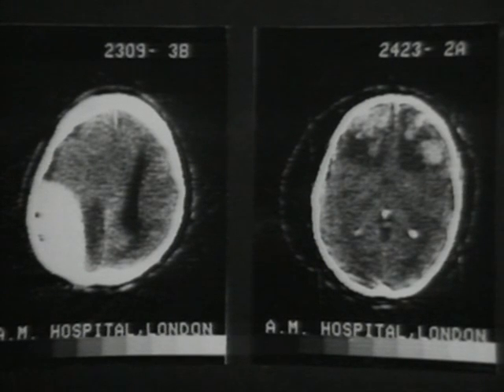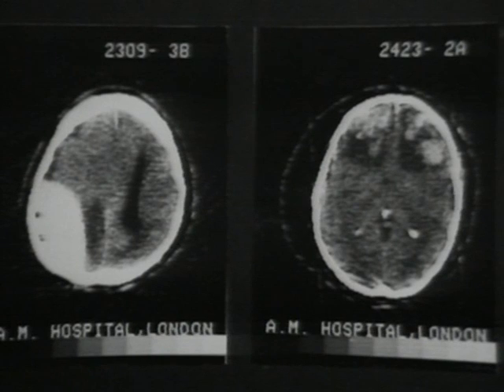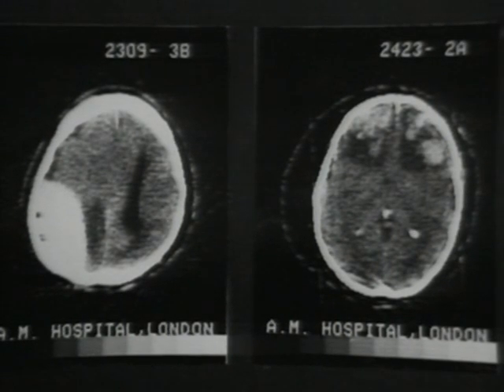The next patient is a different problem. This was a man who was admitted to hospital deeply unconscious with a history of having been sick, fallen backwards and struck his head on the bathroom floor. The question then arose as to what sort of damage he had sustained to his brain. Did he have an extradural hematoma, subdural hematoma, an intracerebral hematoma, or was his brain merely contused?